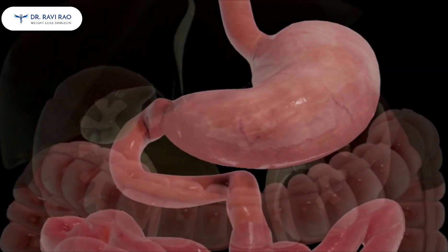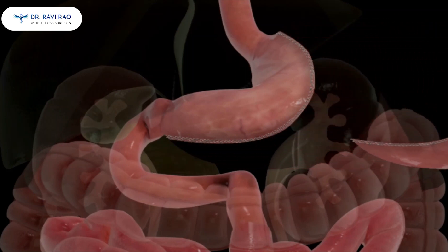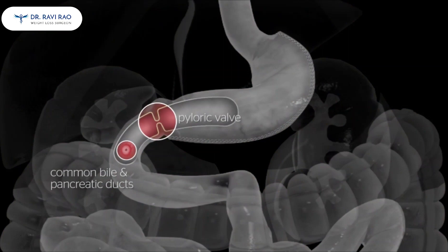The single anastomosis duodenal switch, or loop DS, begins with a sleeve gastrectomy in which a thin vertical sleeve is created using a stapling device. This sleeve will typically hold between 100 and 150 milliliters and is about the size of a banana. The resected portion of the stomach is removed. The small bowel is divided approximately 3 centimeters beyond the stomach, preserving the pyloric.